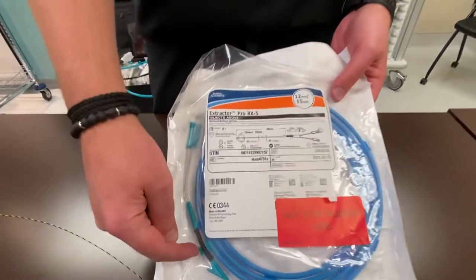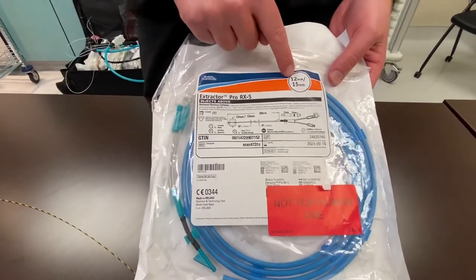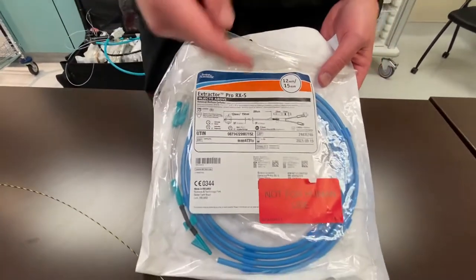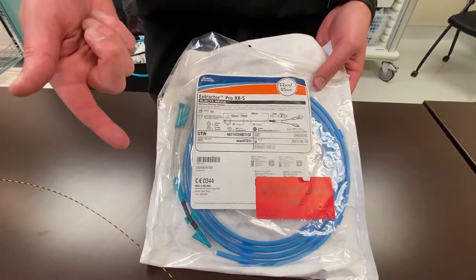The S means there's a stylet, and we'll get to that in a moment, but this is a 12-15. They come in 9-12, 12-15, and 15-18 millimeter sizes.